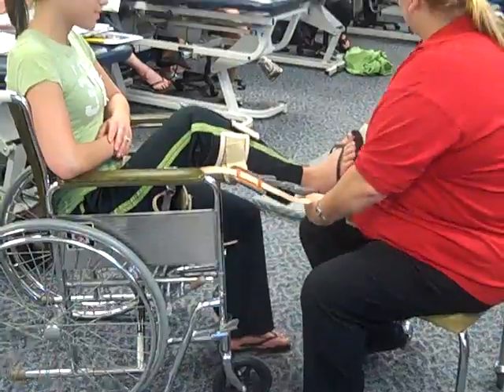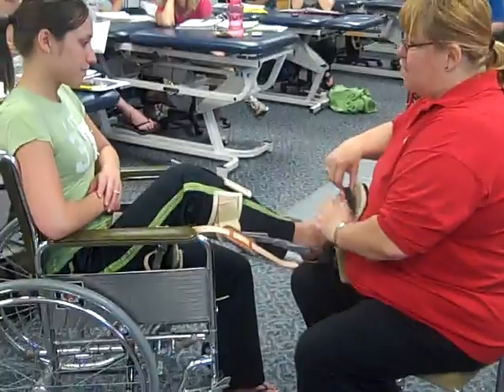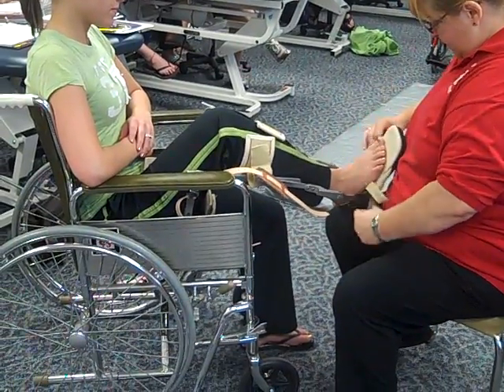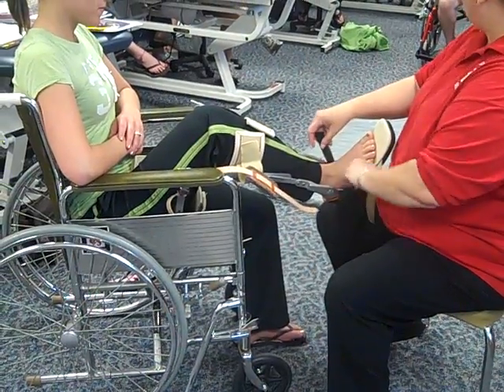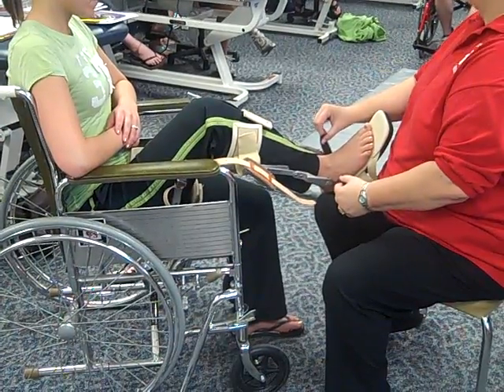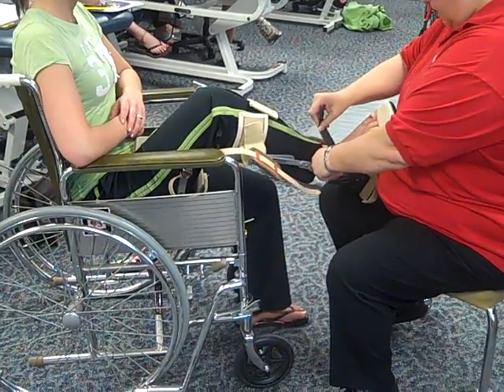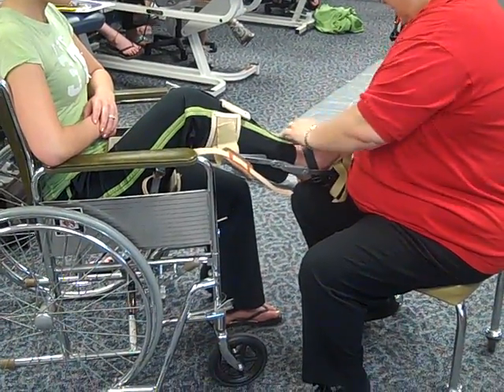The first thing I'm going to situate is her foot. I really would have her in a much better shoe than this. Her heel is against that little cuff in the back. The black strap is going to come up at a 45-degree angle across the front of the ankle, going inside the uprights, because you want it to be nice and firm. I'm not going to go too firm because it's right against her skin. So we have that one done.